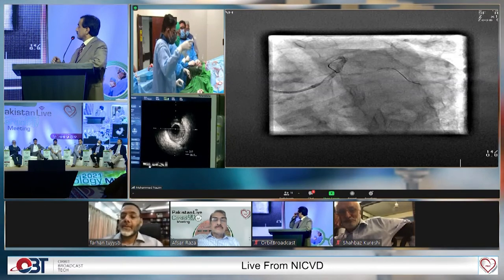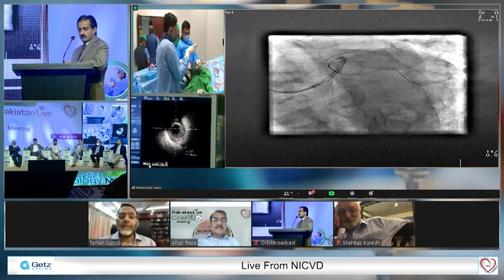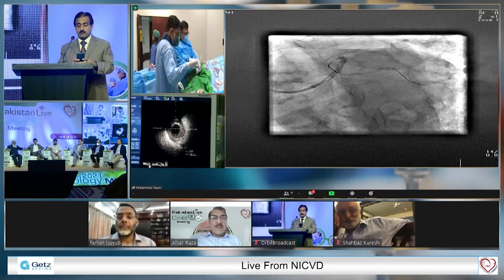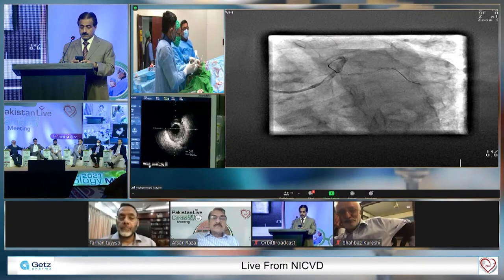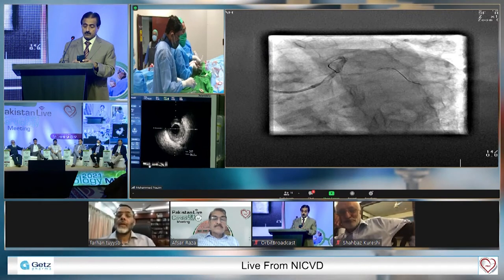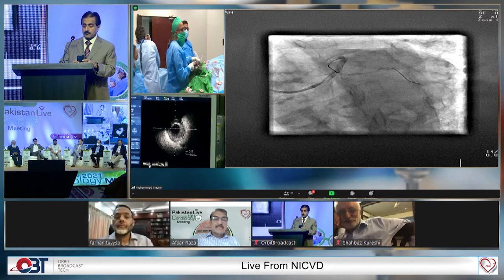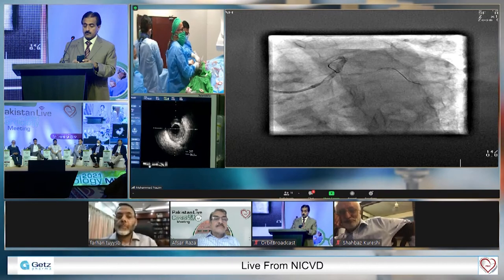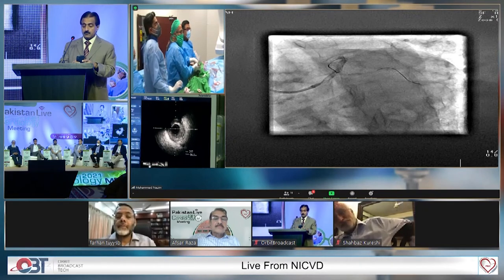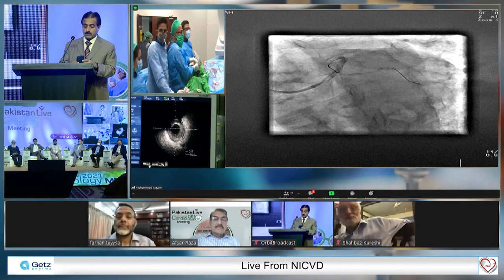So Dr. Javed, my question is that if you have a compromised circumflex ostium, what are your plans then? How will you retrieve it? There are very limited options available, and that is the only option once we have compromised flow in the circumflex. Probably in the back of our mind, in my team, we will go for TAP if we compromise. So you plan to do either a TAP or a culotte? Probably we'll go for TAP. Okay.